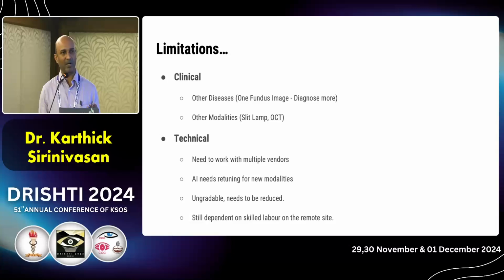And you'll also have to tune your model. Suppose I'm going to use the same algorithm in Japan or in Europe, the Asian eyes are not equal to their eyes. So then you'll have to change the model. Or if someone from Europe is going to come and get his algorithm to work in India, it is going to change the model.